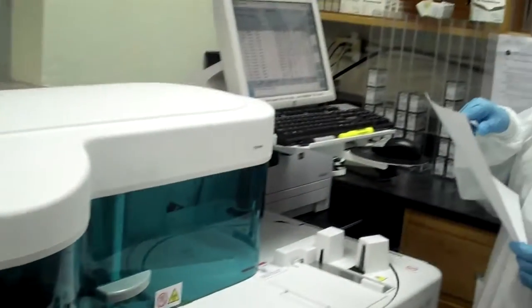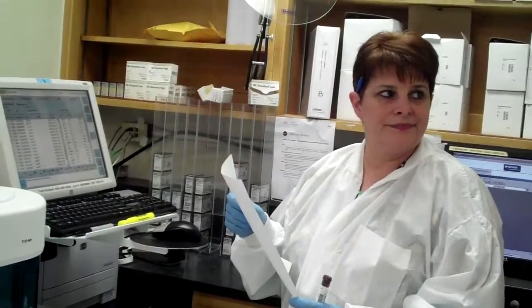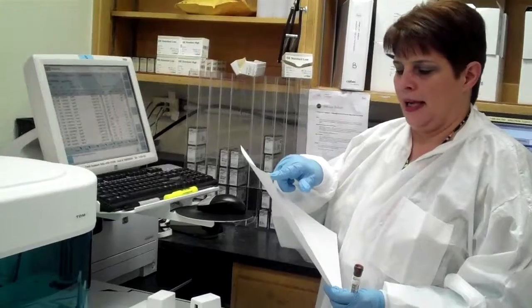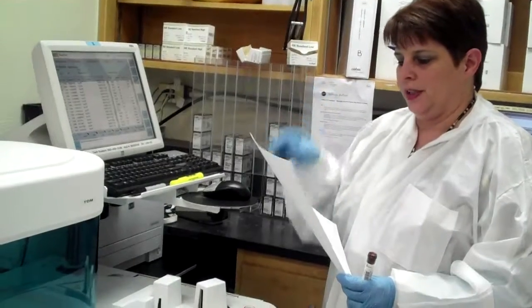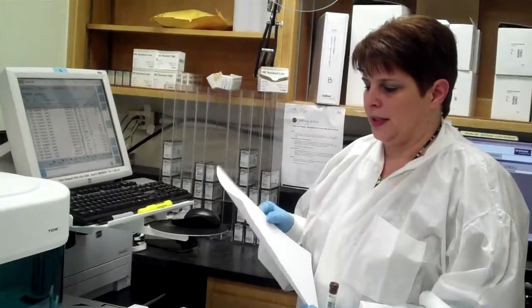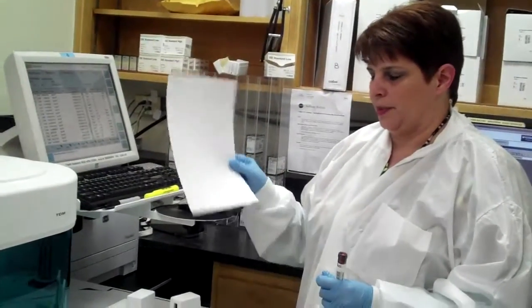And there's some tests for the liver: the total bilirubin, alkaline phosphatase, AST. Are those all terms you've heard yet? The AST and ALT can be associated with the liver primarily, but other organs as well. There's total protein and albumin, calcium, amylase, lipase, and it does certain calculations for you, such as the anion gap, the globulin, the albumin globulin ratio. So it's pretty all-inclusive of the basic chemistry tests that are done as part of any panel.